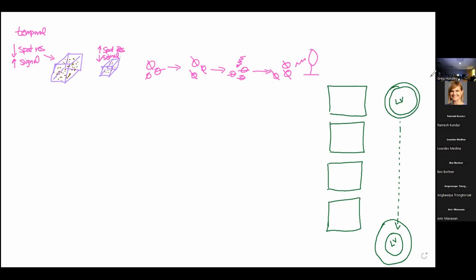So what we do in MRI, inside the bore of that scanner we talked about, well, here's our MRI scanner. And inside the bore of that scanner, to create that magnetic field, there's a lot of copper wire. And that's used to create a magnetic field. But in addition, within that magnet, sitting right around these bores, are some other smaller magnets that we turn on and off, and that's what you hear making all that noise, right?